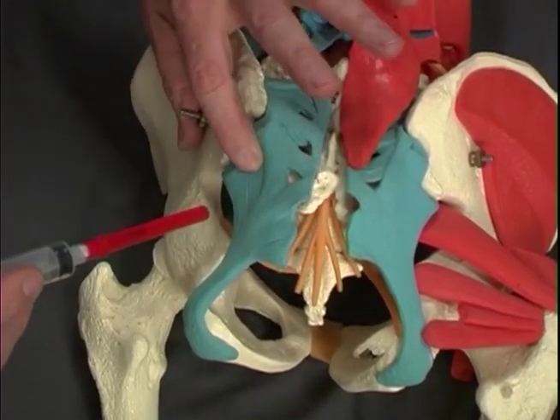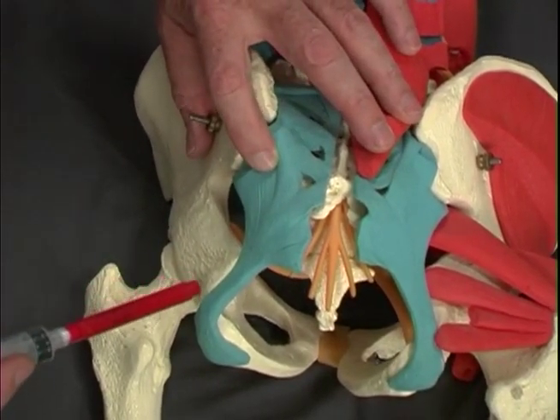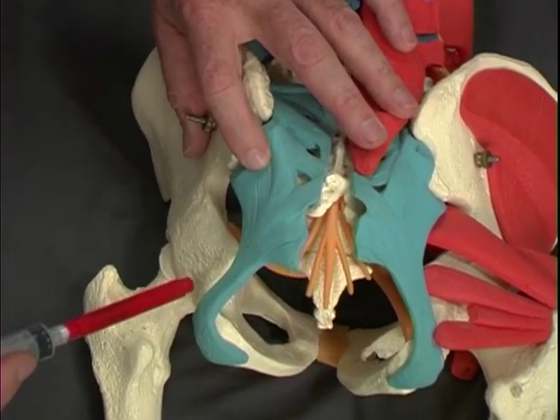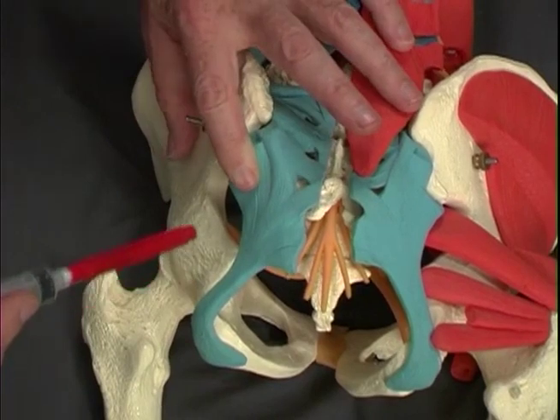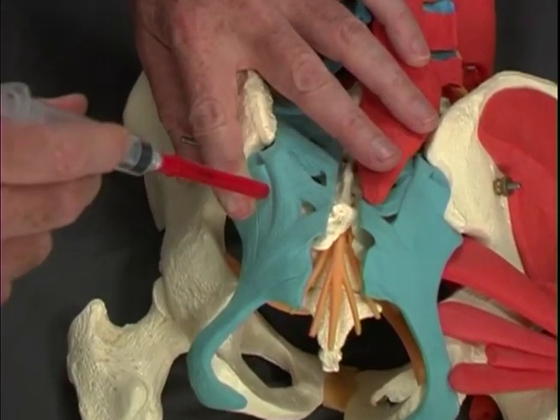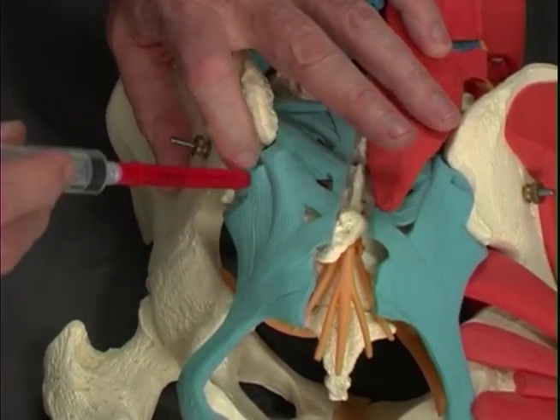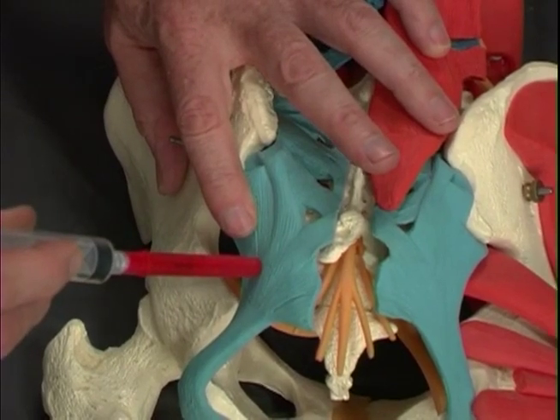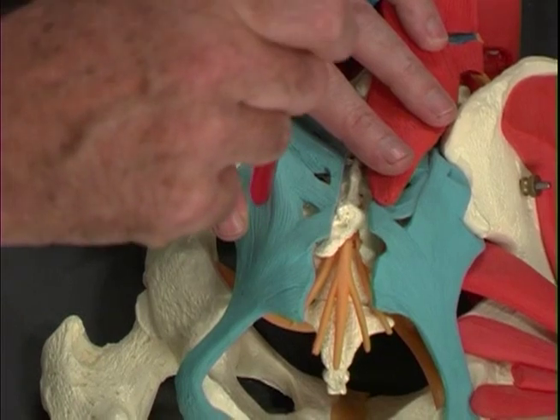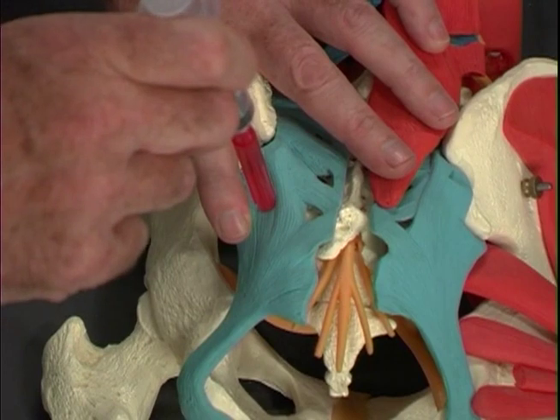We feel the edge of the sacrum, realizing that that's often the perceived edge rather than the real edge, since there's a lot of tissue between us and the bone. We push down that tissue as much as we can and come in a lateral direction to medial, trying to find the very edge of the sacrum, which is where those ligaments attach on the sacrum itself. If we can't find it, we can come back up and come in a straight down direction and move medially until we hit the edge of the sacrum.